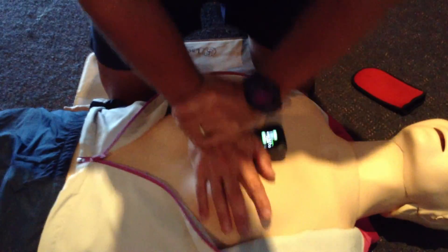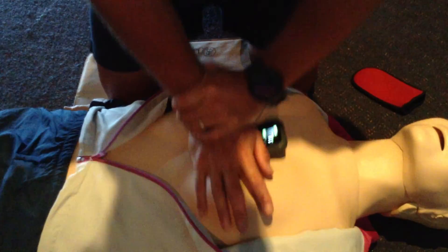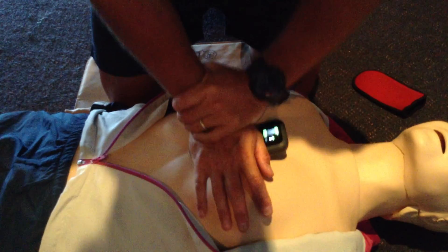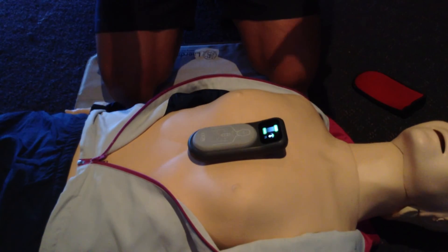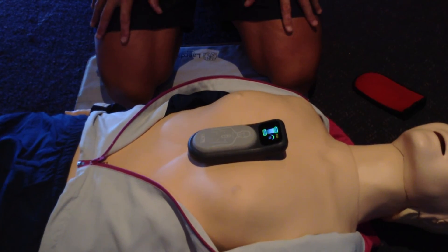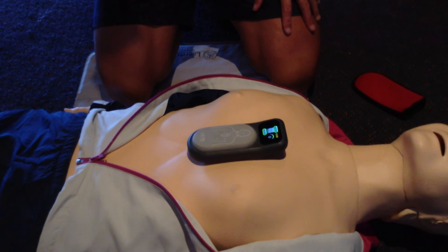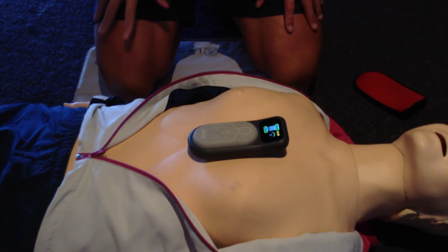So now I'll bring everything back into line again, and it's all good. When I take my hands off the chest of the mannequin and the device, a counter kicks in and it's now counting every single second that hands are off the chest of the mannequin.